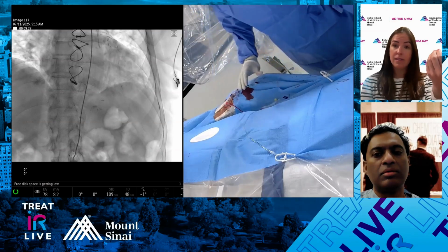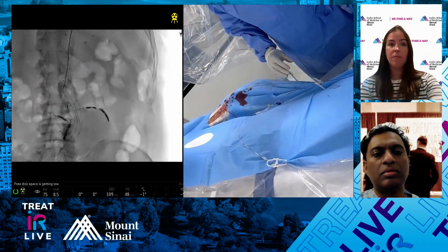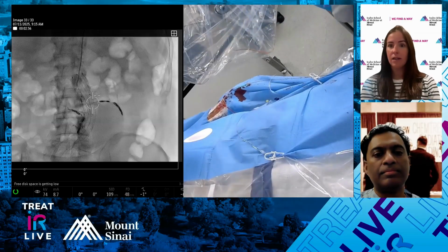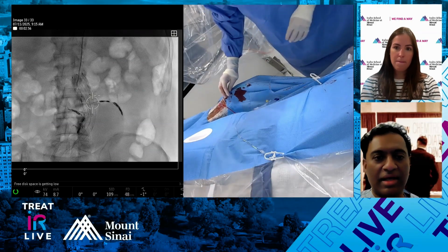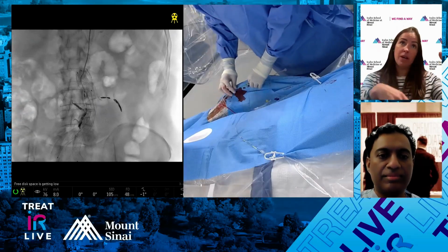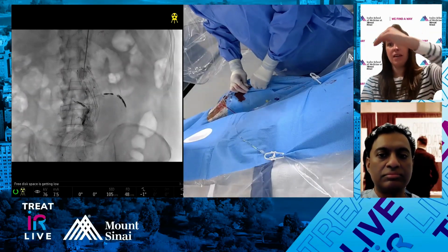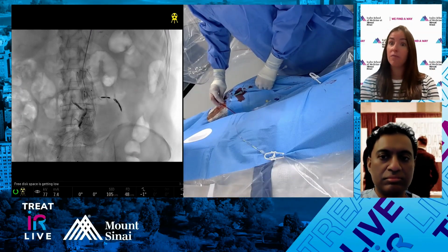You can kind of take it down, form it, and then it'll hook. If there's a lot of tortuosity, it hooks the descending. So it's a nice trick to know. You'll form the Sim one in the ascending / arch. Correct, in the ascending, and then once you're coming up the arch, just keep that right. The reverse third actually hooks on the descending, and it's very nice.